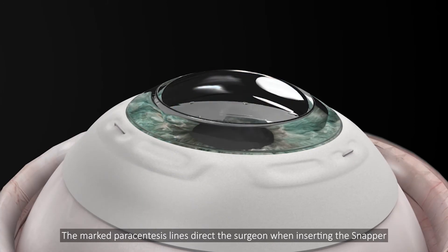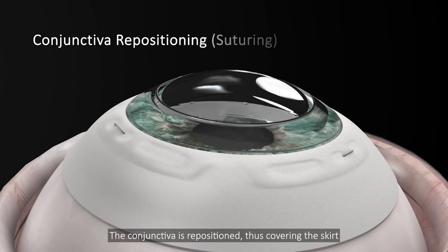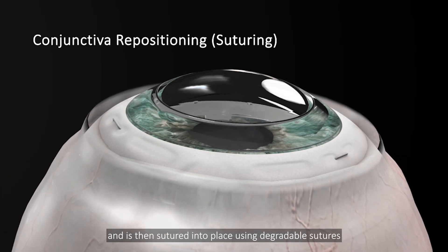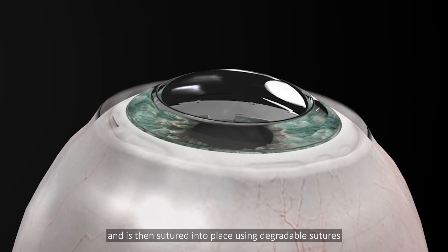The marked paracentesis lines direct the surgeon when inserting the snapper. The conjunctiva is repositioned, thus covering the skirt, and is then sutured into place using degradable sutures.